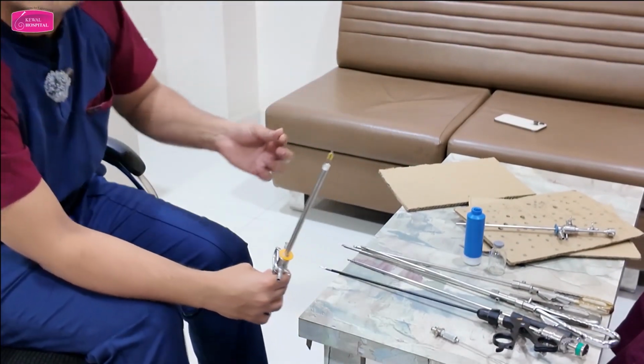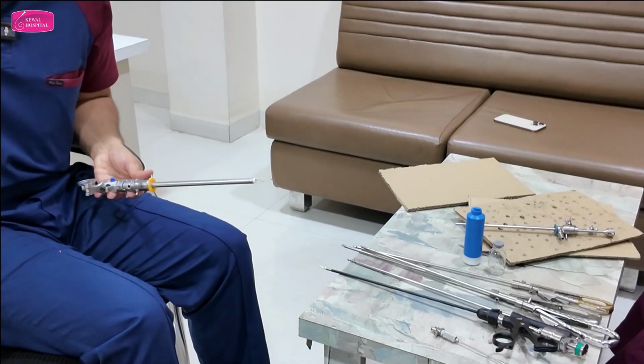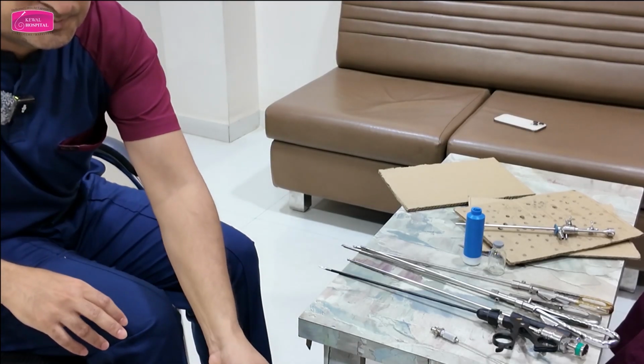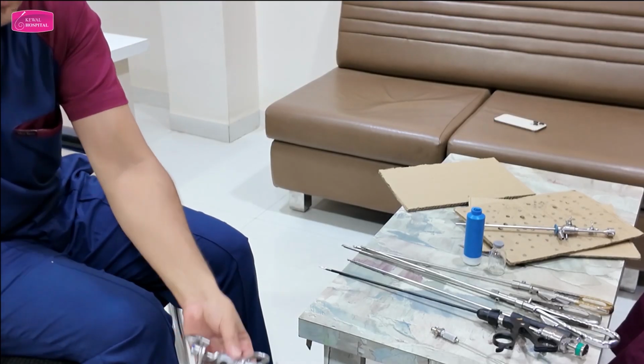So through the scope, is there a 4mm scope? Bring it. I will show you in the camera itself, so how it looks. Or if you want, I can show you right now also.